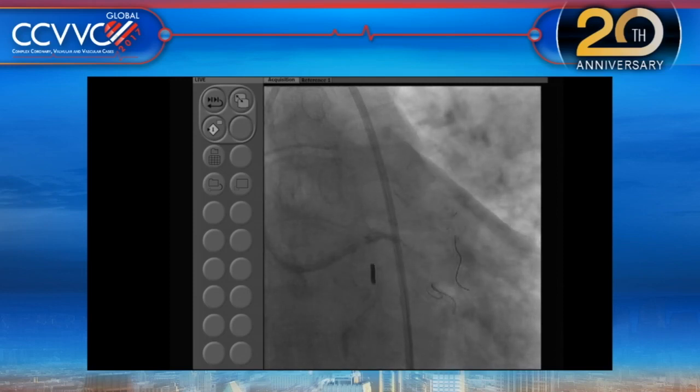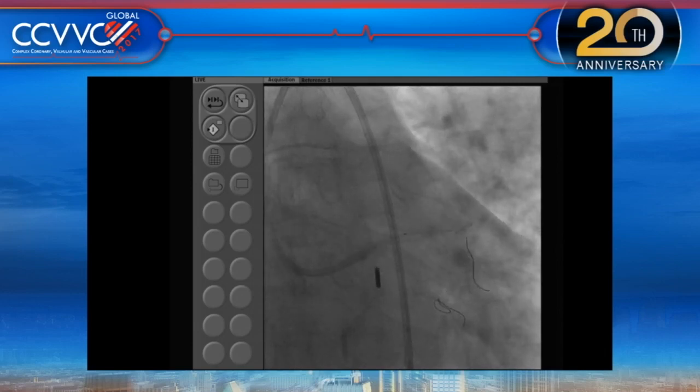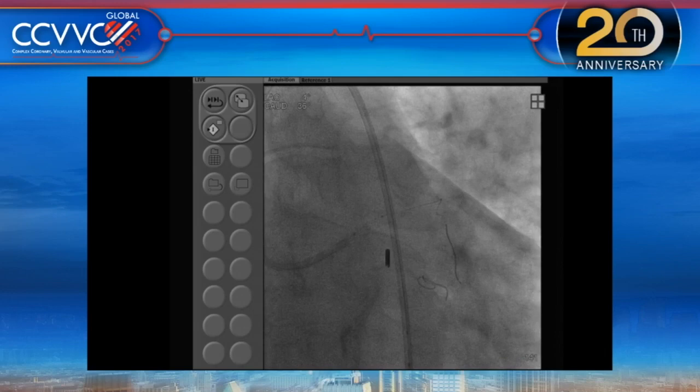So Marie-Claude, Anu, because we need to get some lunch at some point, tell us exactly what you're going to do until the end of the procedure. What I did is I kept the deflated balloon in the LAD, went with the 2.0, created a channel for my NC balloon. So we have a 3.5 high pressure balloon in the LAD. Now I'm going with the 3.0 high pressure balloon in the circ, and we'll do the final kissing balloon. And you will image both limbs, from the left main to LAD. Okay.